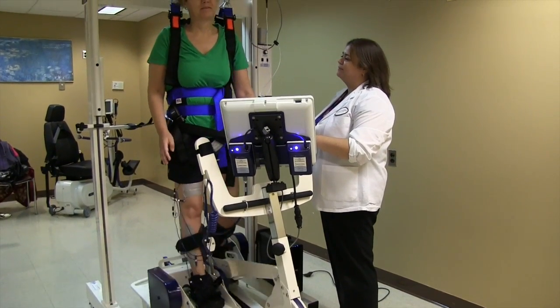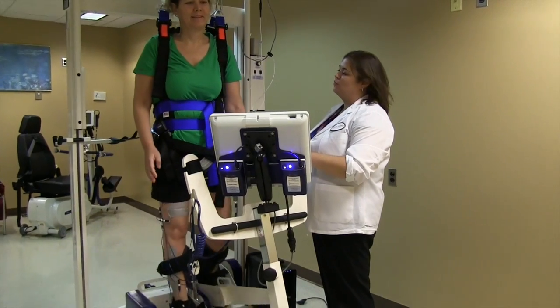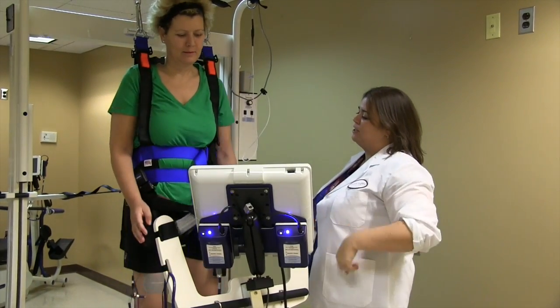Left leg, right arm — right, left arm, right leg. The normal pathways are not there. The connections keep changing, keep regenerating.